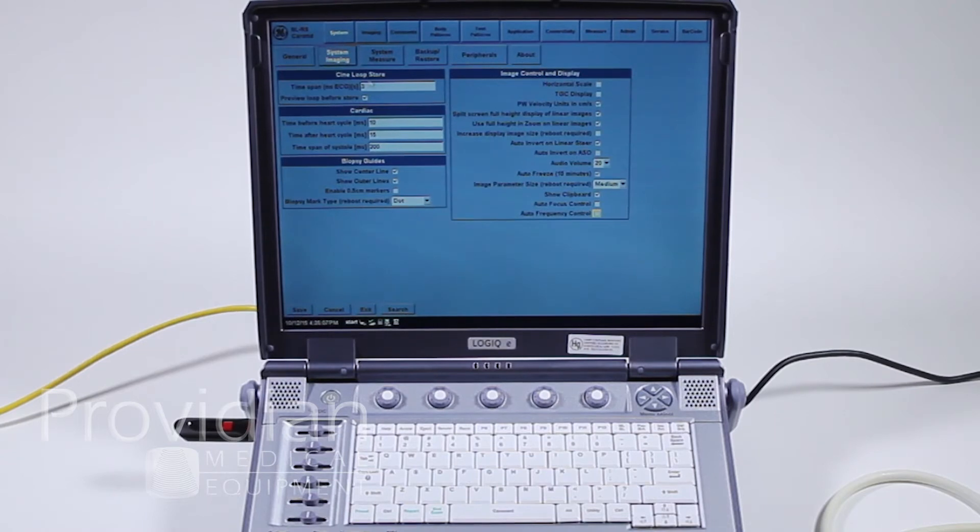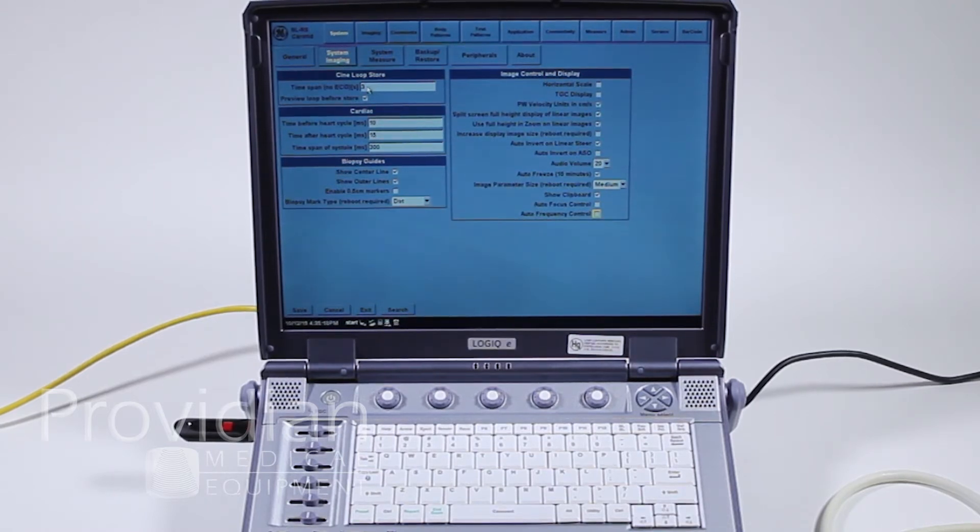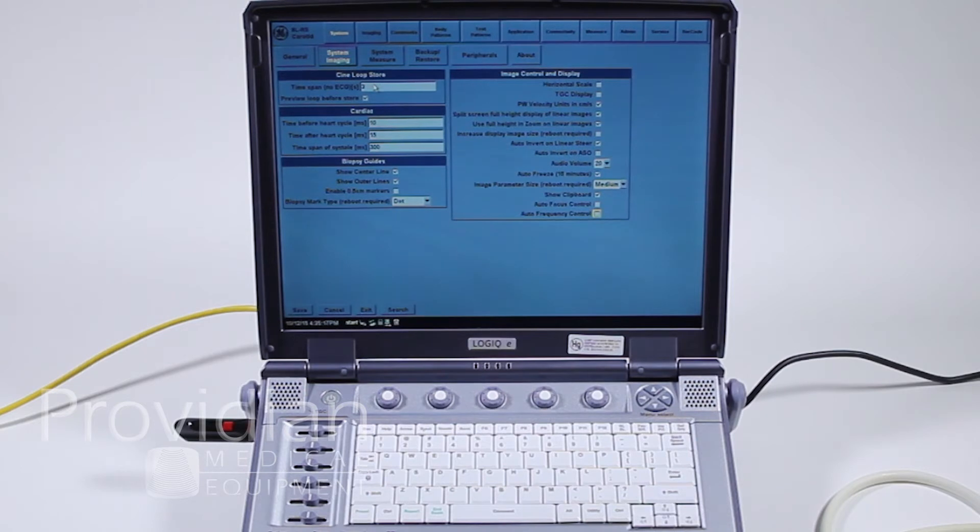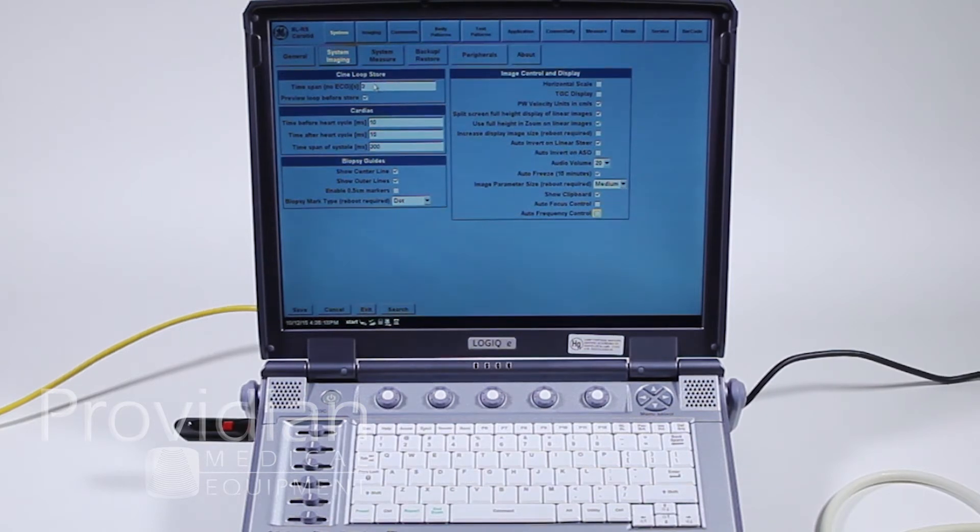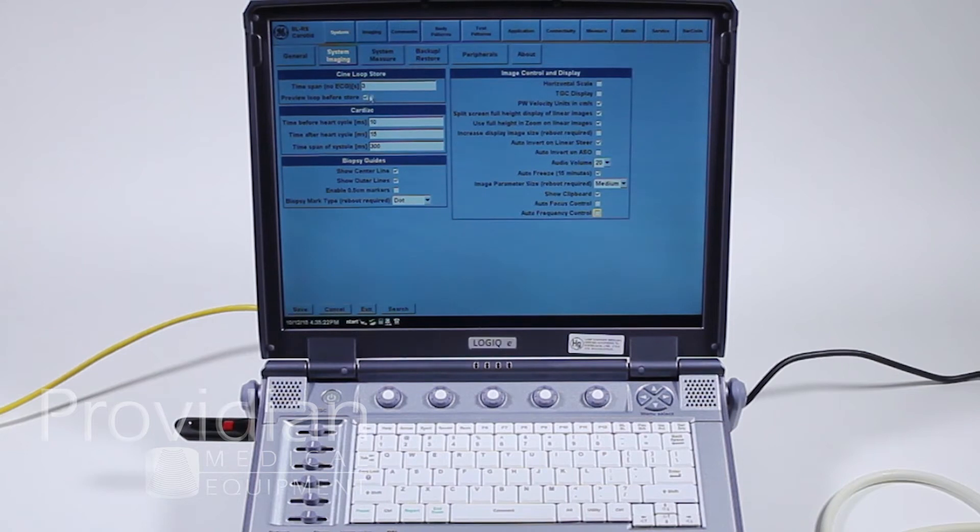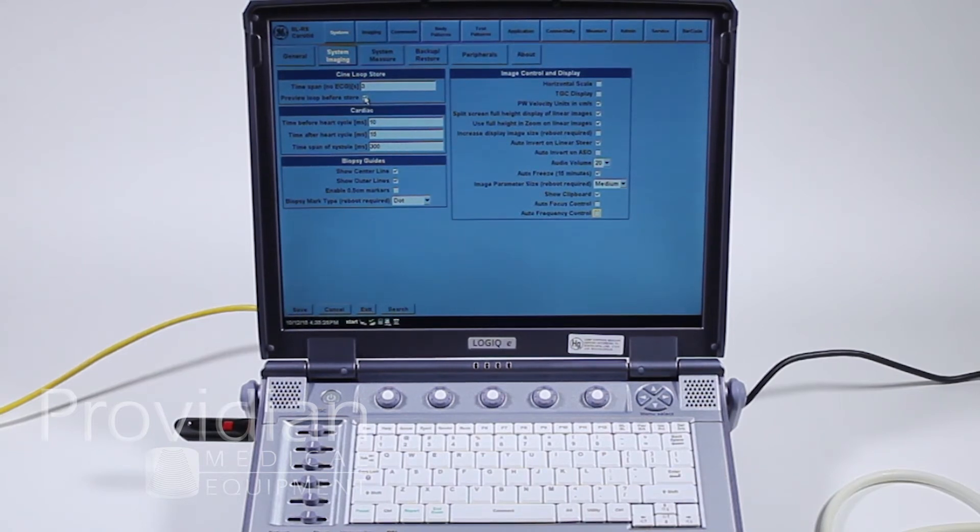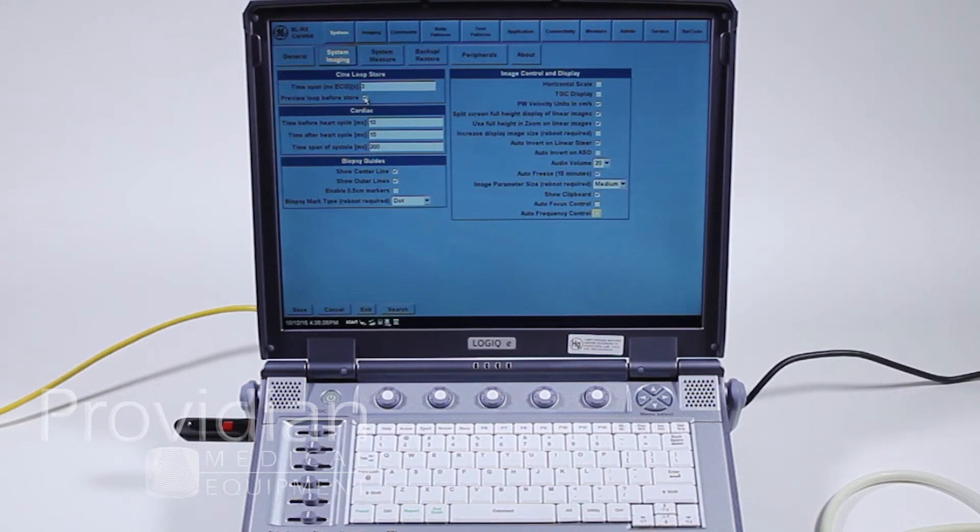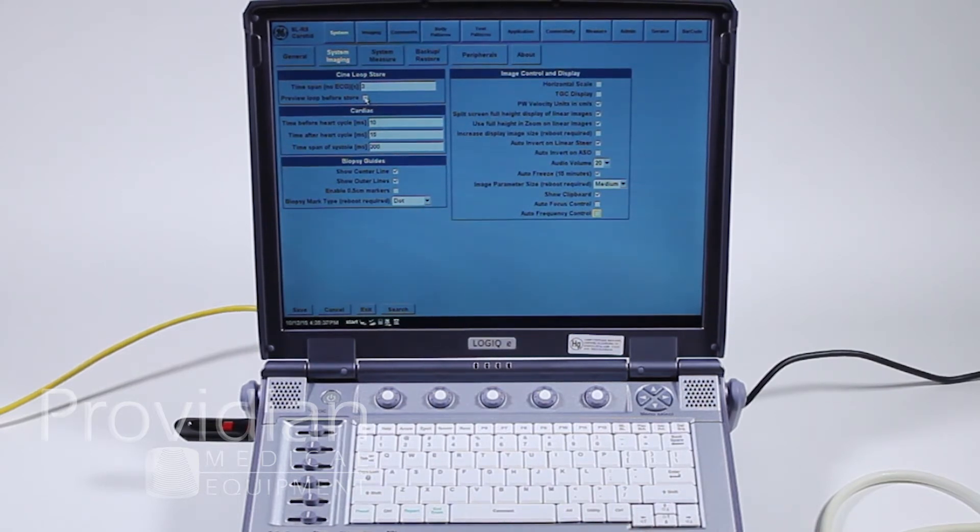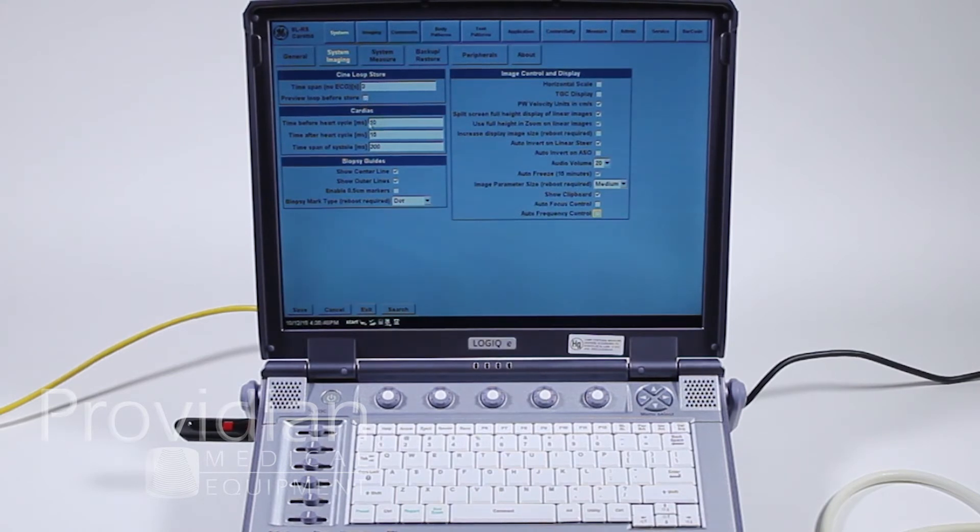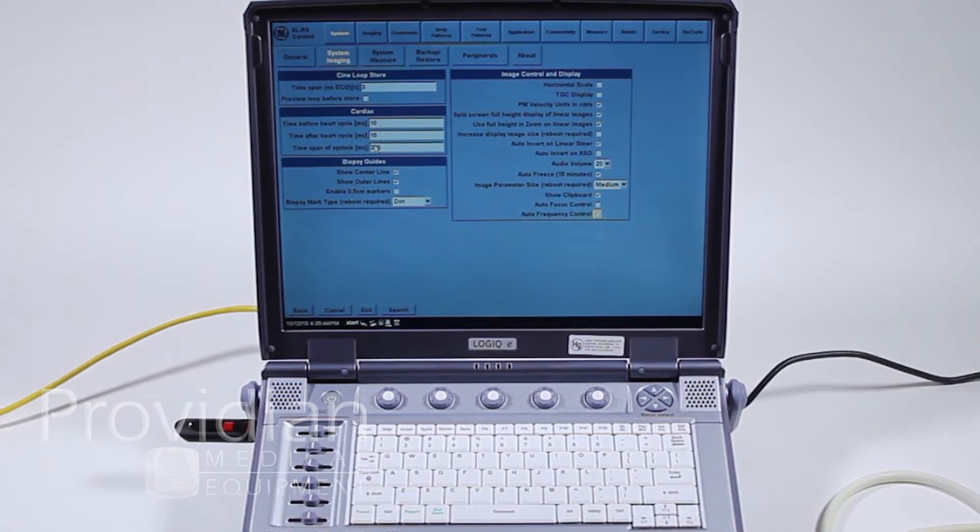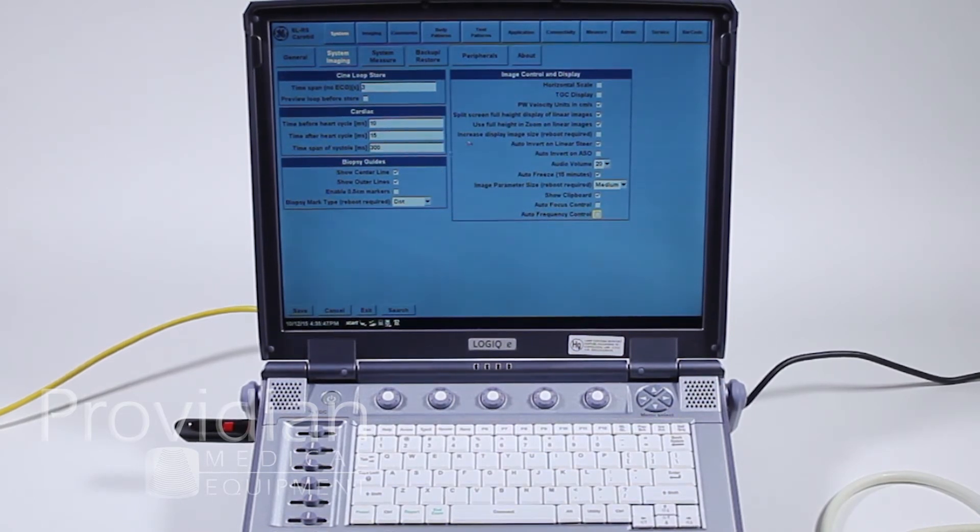System Imaging, this is where we talked about storing loops with no ECG. When I hit that P1 button in a live image, it's saying I'm going to store three seconds of the image before I go. So I had to hit it twice because it's saying I've got it checked here to preview the loop before store. So when I hit P1, it would start playing back that loop and I'd have to hit P1 again. If you just want to keep going, you hit the P1 in live imaging, it's going to store the last three seconds and it'll just keep going. You don't have to keep hitting that.